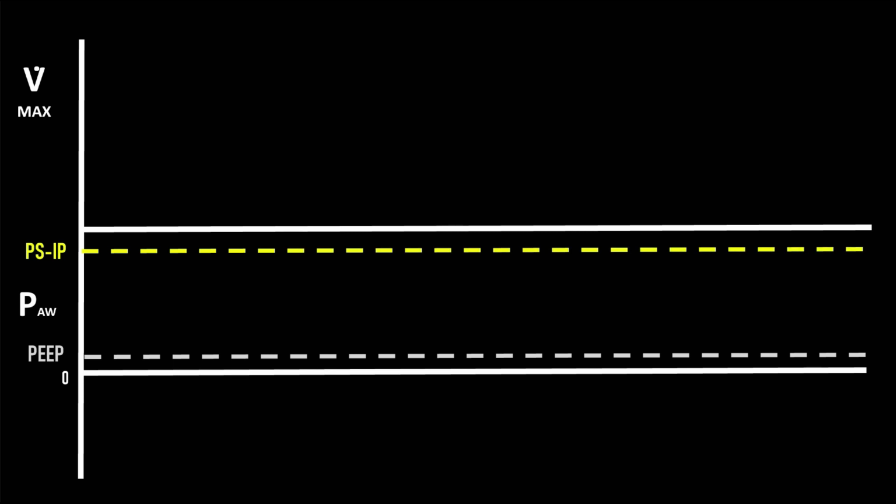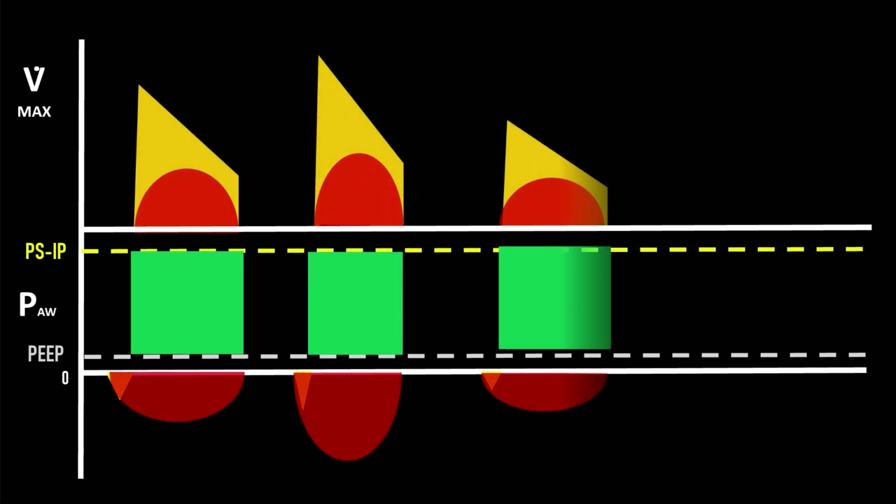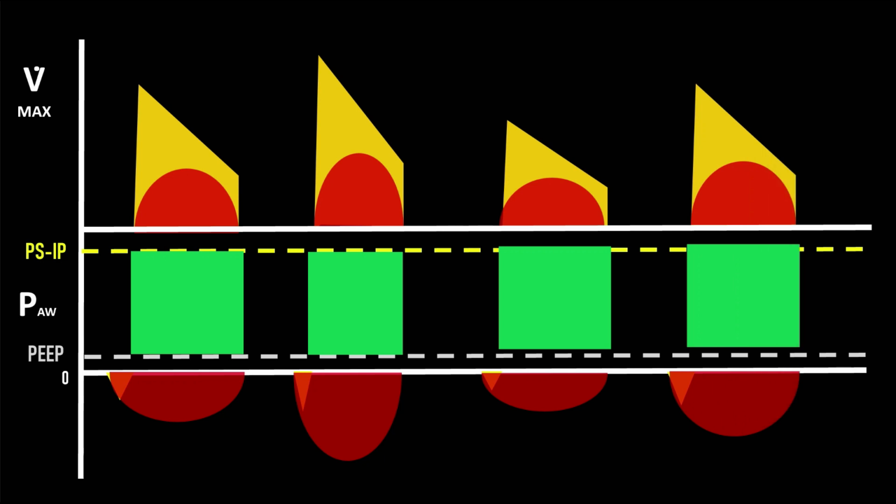This is a graphical representation of pressure support. Everything in red is the patient's own efforts. Flow is in orange and the airway pressure is in green, as I've previously shown you in this tutorial. The tiny triangle before the beginning of each breath is the trigger. As you can see, from breath to breath, there is a huge variability in patient effort. That's in red, those sinusoidal patterns, despite the airway pressure being unchanged. The patient may be really gasping, for example, in the second breath, but this only manifests as a slight increase in tidal volume, and bedside practitioners may miss the dramatic increase in flow demands.